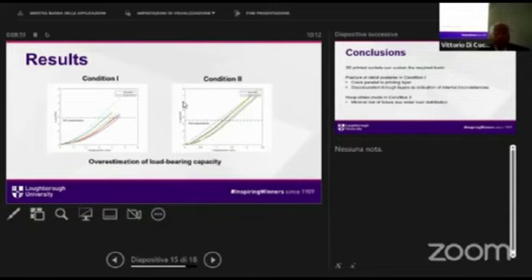And here you can see generally that we have the results of the simulations, which are in the blue line, which are much better reproduced in the condition 2 than in condition 1. The important part is the horizontal dashed line, which demonstrates to you the load-bearing capacity of the socket, which is supposed to be met for any device of this type. And as I've already mentioned, all the 3D printed sockets have successfully met the condition 1 criteria, exceeding this level by some margin.